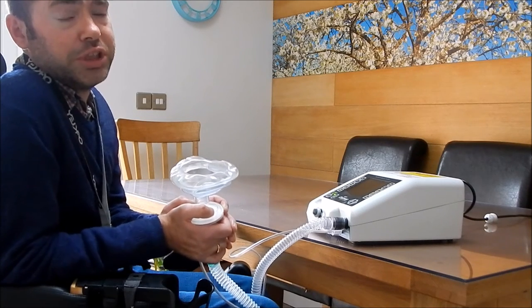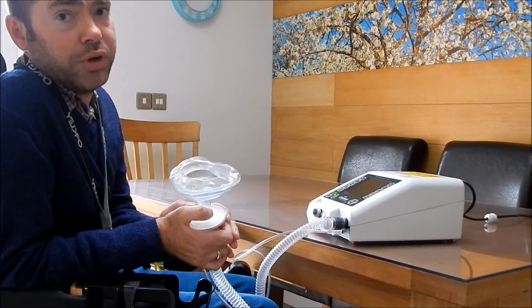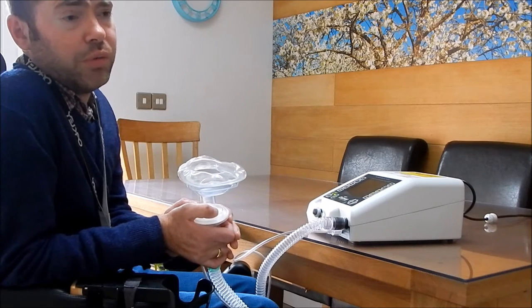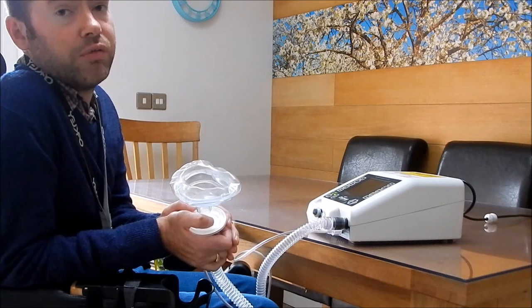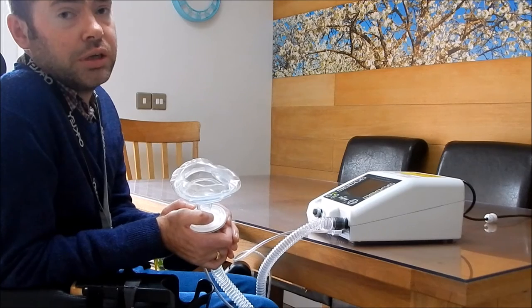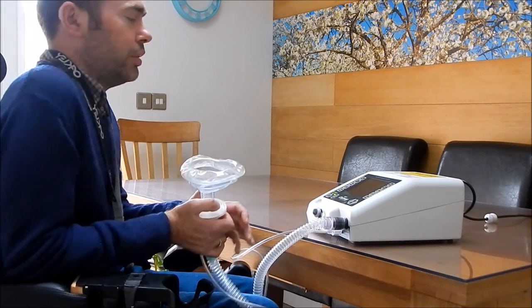All the machine does is five cycles of breathing in, breathing out - so you just follow what the machine does. Try and avoid pulling the mask off when it's putting air into you, and they don't cause any damage. All you do is turn it on.